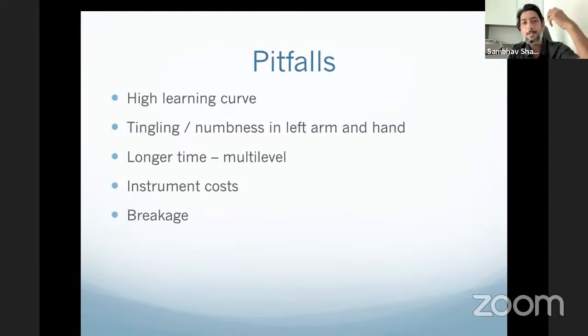Initially, as a surgeon, you will start feeling tingling and numbness. You have to hold the camera, the scope, in your left hand, and the whole arm will start becoming numb. But it is something you just get used to. Over time, then you go into multi-level.